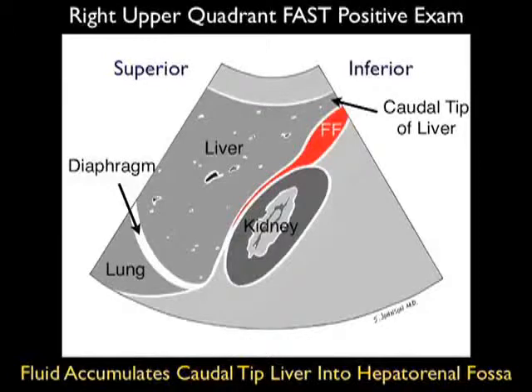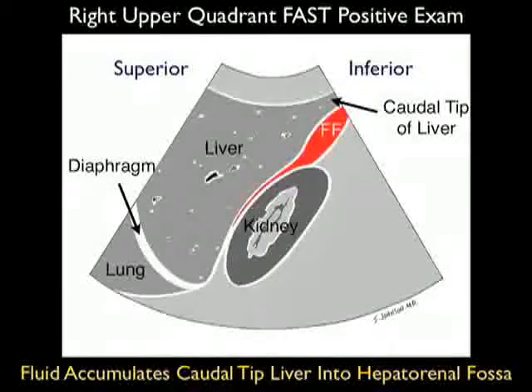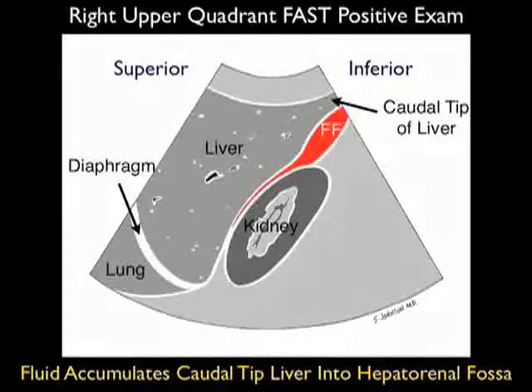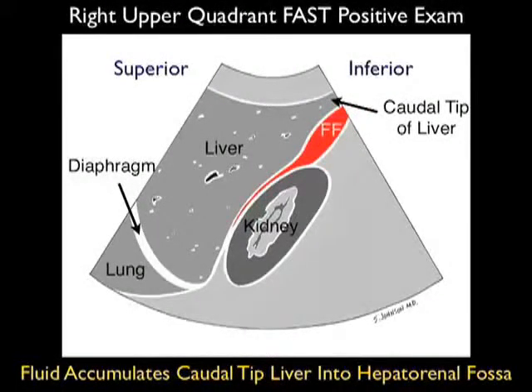Now this is very important to emphasize: many times fresh fluid can only be seen around that caudal tip of the liver, and then it will move into that hepatorenal interface or Morrison's pouch.